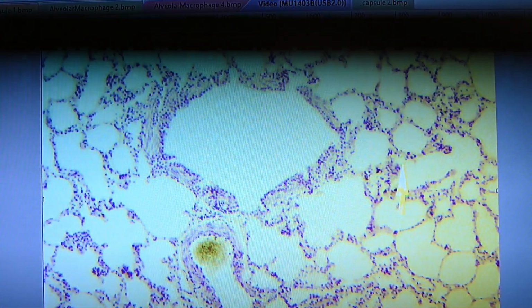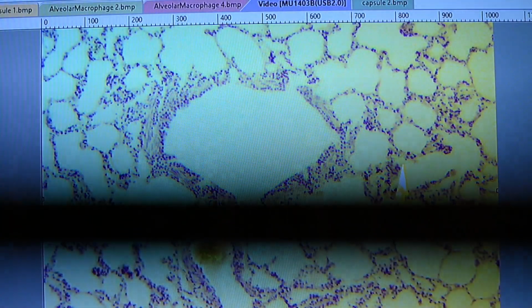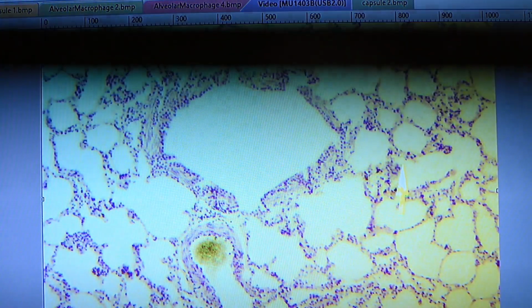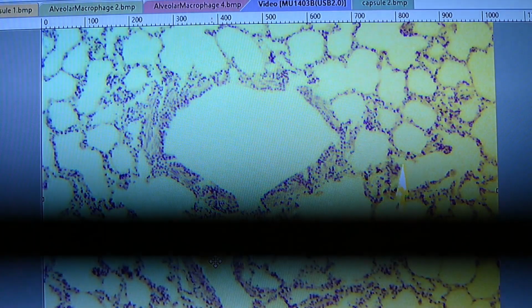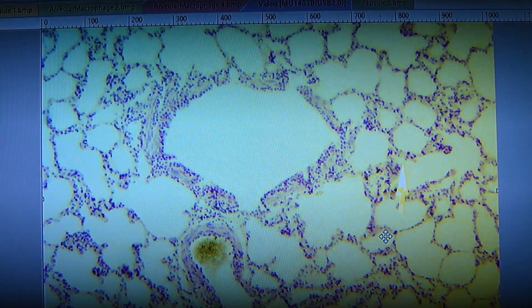Here we have an example of an even smaller, I'm sorry, not an alveolar duct, we have a bronchiole. Here we have a smaller bronchiole, and adjacent to it down below here we have an artery following it. There's still some smooth muscle over here and around the outside of this bronchiole, but alveoli surround pretty much everything outside of this bronchiole and that artery there.